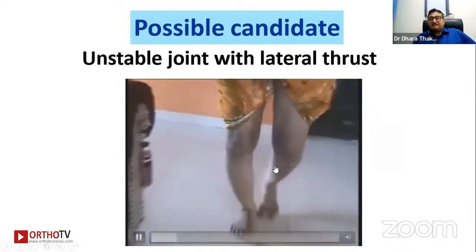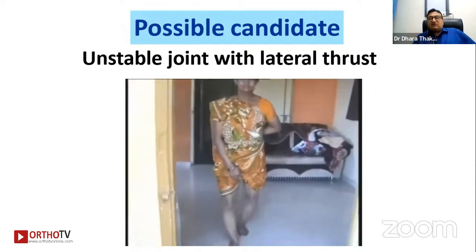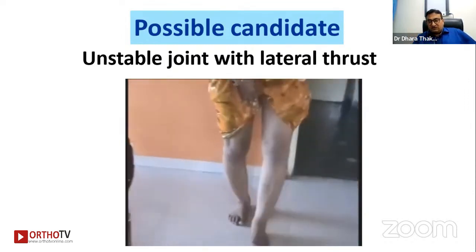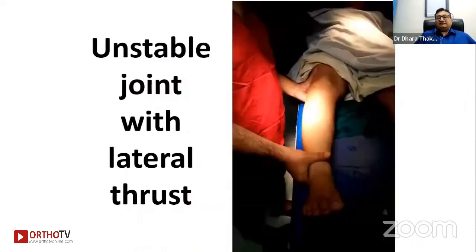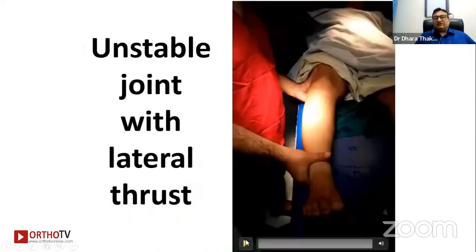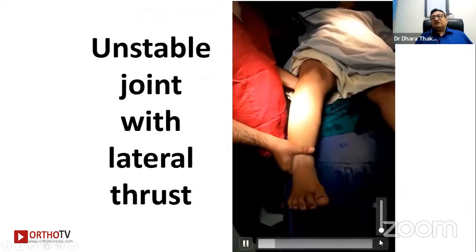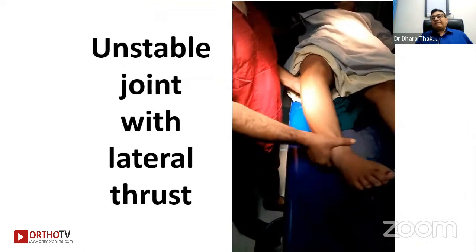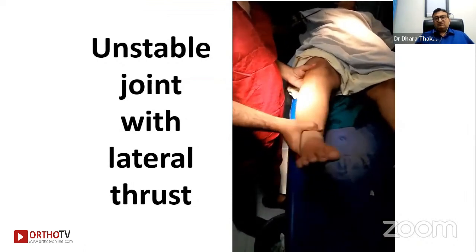On the left side, we can see the proximal tibia migrates laterally on weight bearing. This is a lateral tibial thrust on weight bearing. On left side, we can appreciate that. And if we examine her clinically, there was laxity of lateral collateral ligament. Not only laxity of lateral collateral ligament, medial collateral ligament was good.